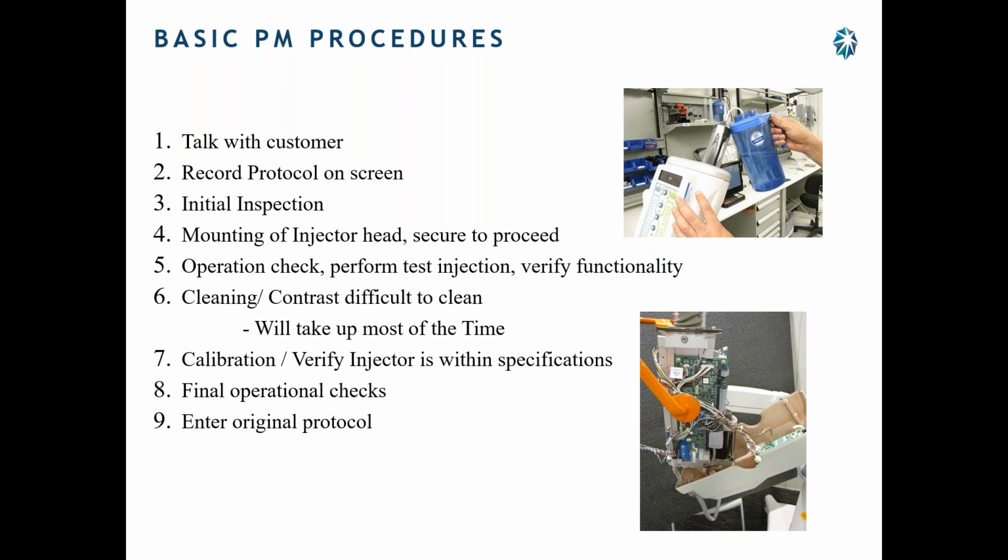Basic PM procedures. Talk with the customer. The customer knows what's wrong with that machine. They use it day in, day out, right? I'm having a little issue with this button here. Okay, great. Now you know what to look for. Record the protocol on the screen before you start. Why is that? Some of these techs only know what's on that screen. If you leave something different on that, they won't know what to do.